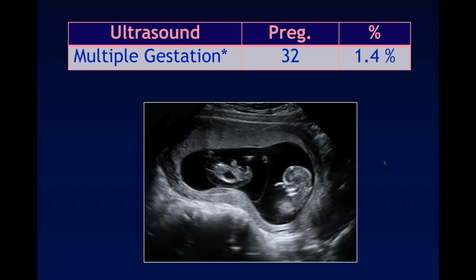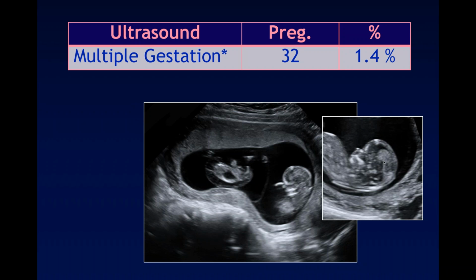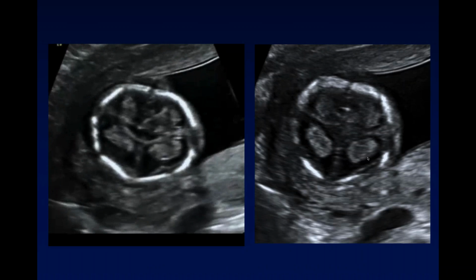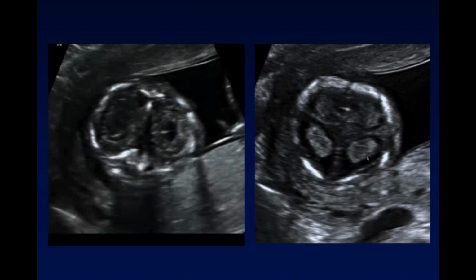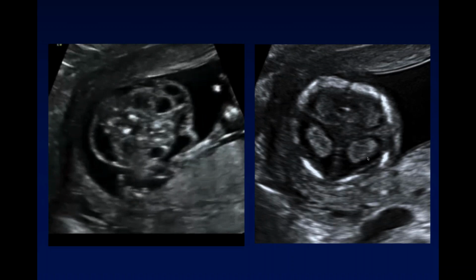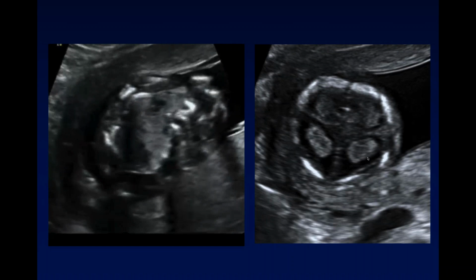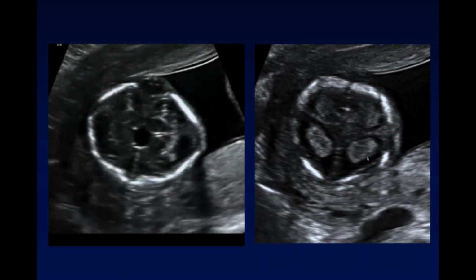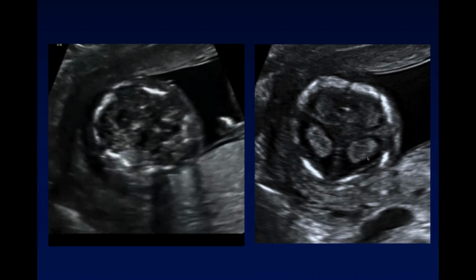In this particular case, you have a set of twins, and one twin is completely normal looking, but look at the other one. The other one is cystic and amorphous in its configuration and has reversed arterial flow. This is a fetus with reversed arterial perfusion, or a trap twin, or an acardiac twin. And what about this fetus? This fetus had a negative cell-free DNA, but if you scan through the head, you can see that it's conjoined, and the intracranial anatomy is abnormal because it has 4 different sets of choroid plexes. Cell-free DNA screening in this situation is not really going to be particularly contributory.